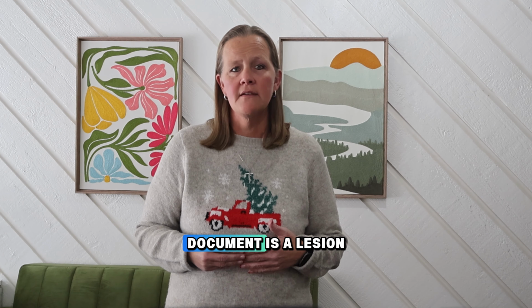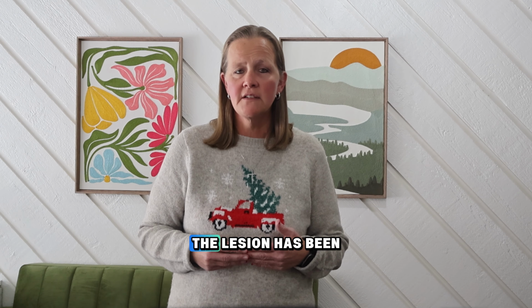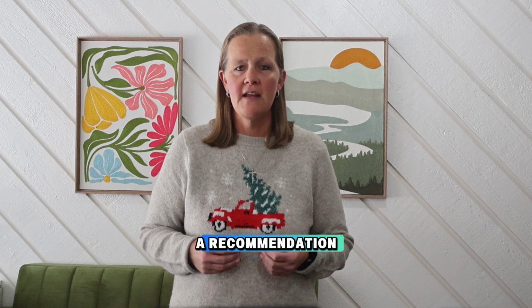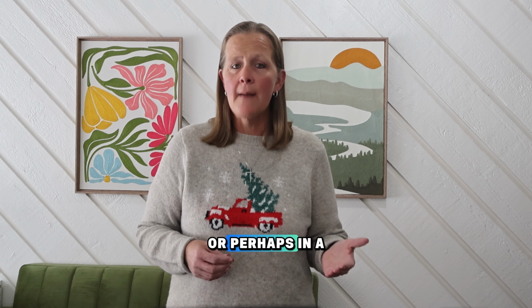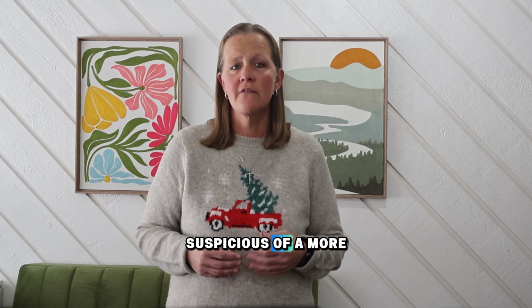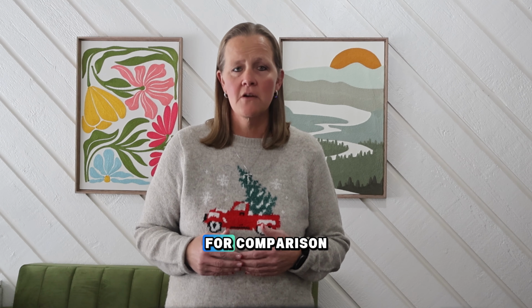Another thing we may document is a lesion or sore in the mouth. The doctor will usually question the patient as to how long the lesion has been there, and then will make a recommendation as to when the area should be rechecked, which may be at their next hygiene appointment, or perhaps in a week or two if the doctor is suspicious of a more time-sensitive diagnosis. Again, that initial photo is our baseline for comparison.